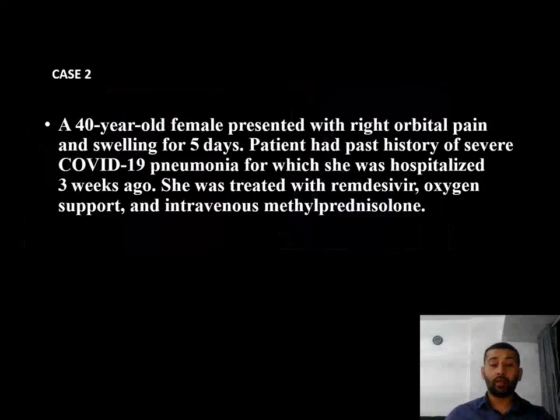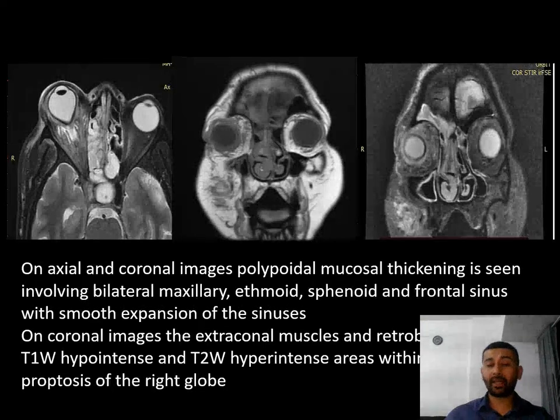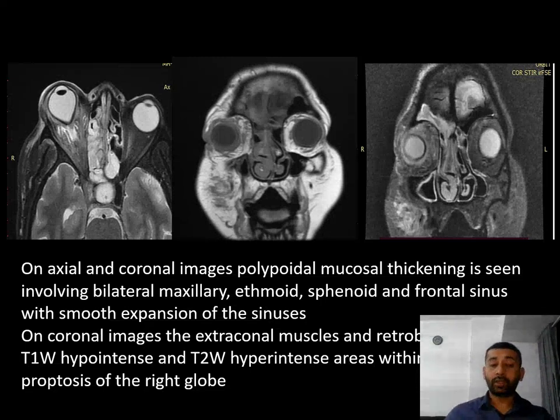Case 2: A 40-year-old female presented with right orbital pain and swelling for 5 days. She had a past history of severe COVID pneumonia for which she was hospitalized 3 weeks ago and was treated with remdesivir, oxygen support, and intravenous methylprednisolone. On axial and coronal images, polypoidal mucosal thickening is seen involving the bilateral maxillary, ethmoid, sphenoid, and frontal sinuses with smooth expansion. The extraocular muscles and retroorbital region show T1 hypointense and T2 hyperintense areas with proptosis of the right globe.